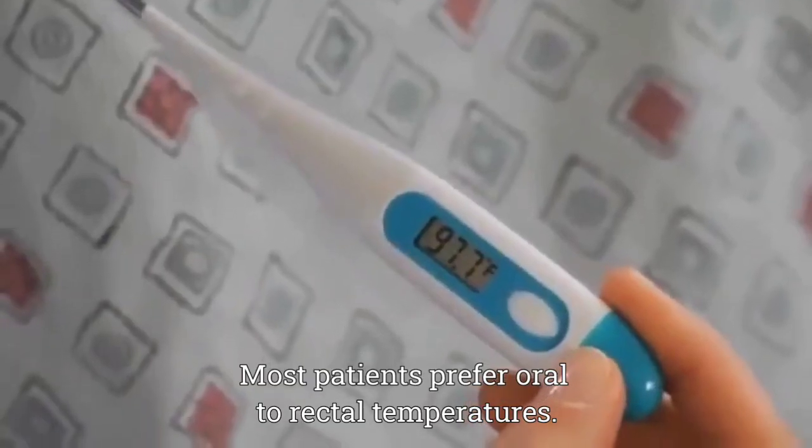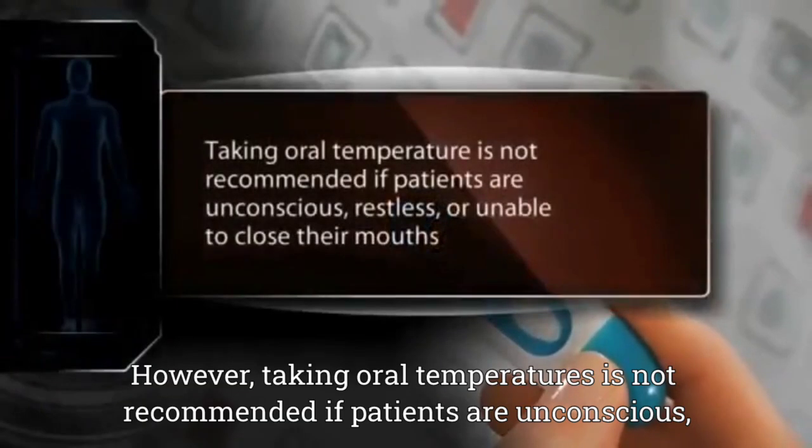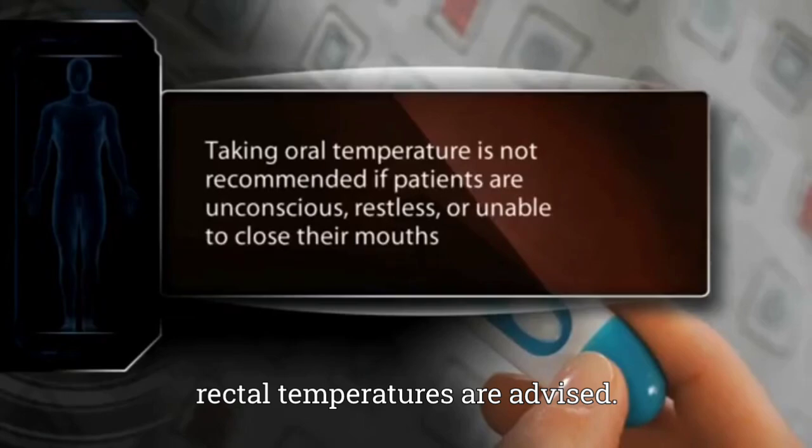Most patients prefer oral to rectal temperatures. However, taking oral temperatures is not recommended if patients are unconscious, restless, or unable to close their mouths. In these cases, rectal temperatures are advised.